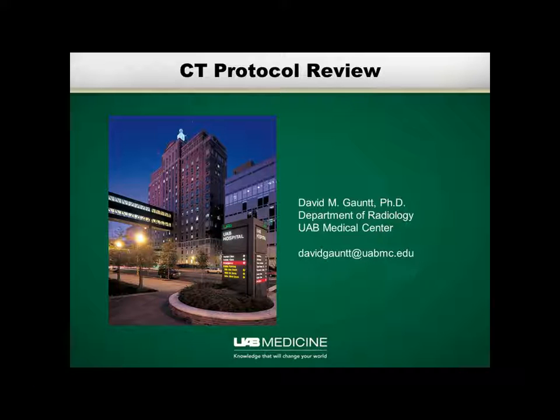I actually practice in Texas, and there's kind of a misnomer about the CT protocol. However, I think it's a good way for us to implement our value like we've been talking about, because the statement in the regulation actually is that they call it the Radiation Protocol Committee, but it's more of a Radiation Policy Committee. So we're setting policies to establish reference levels for those CT protocols and then following up on them. But if, as a committee, which some of my clients have done, we say we want to sit down and review the protocols, then that becomes part of the regulation. And that's why the inspectors are a little bit lax on whether you're looking at the protocols or just having the meeting. So I just thought I'd bring that up.